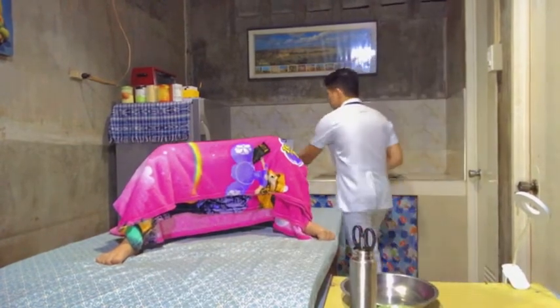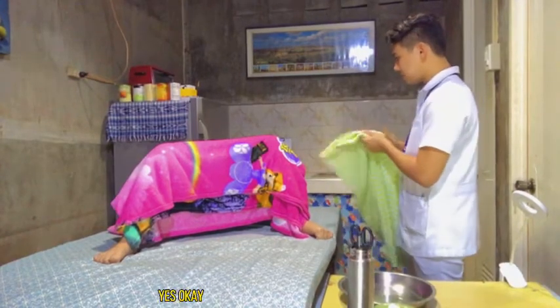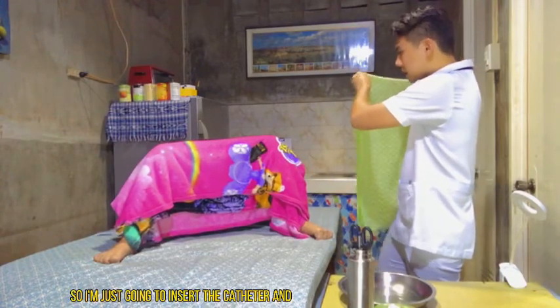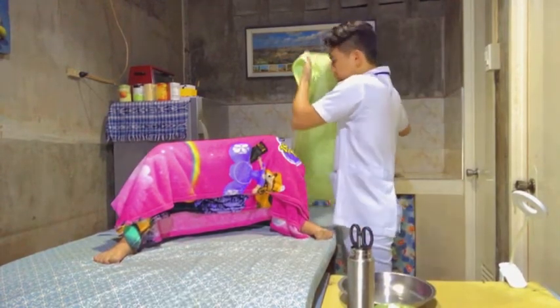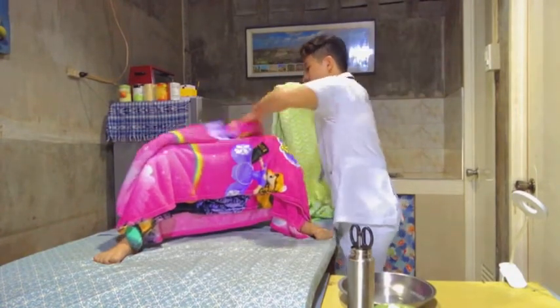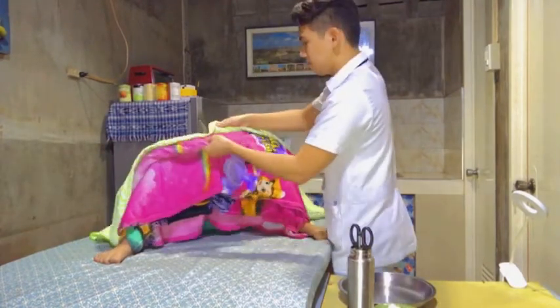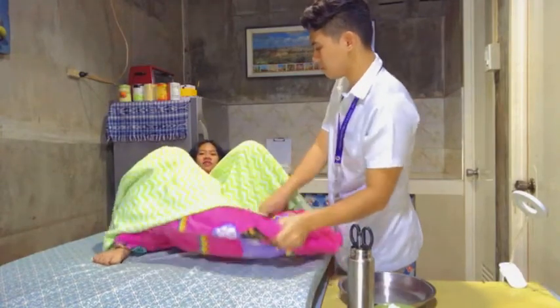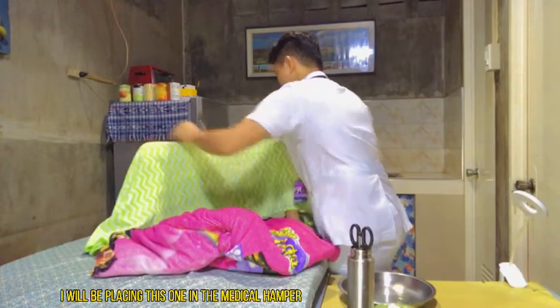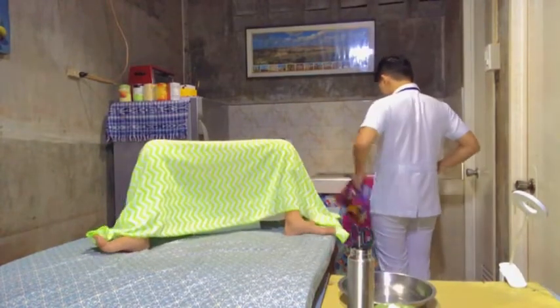Okay, ma'am. So right now, I will be exposing your private area. Would that be okay? Are you ready? Yes. Okay. So I'm just going to insert the catheter and bring back everything to normal, okay? Okay. Can you prepare that one, ma'am? Yes. So I will be placing this one in the medical hamper and I will be providing a new one, okay? Okay.